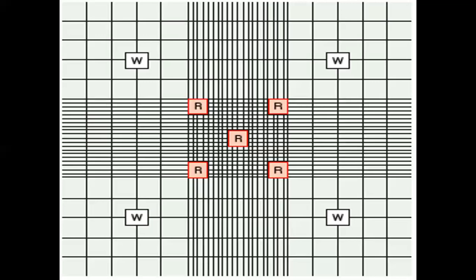Again, that is how you compute your sperm concentration. For your sperm count, you multiply the sperm concentration by the volume.